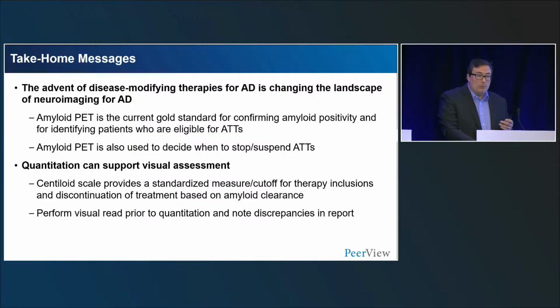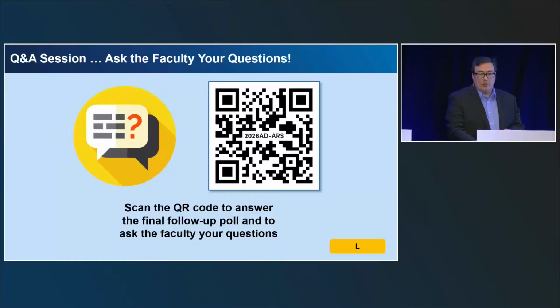I encourage you though, trust your visual read, use it in conjunction with the quantitation. Don't let one supersede the other, and certainly don't let the quantitation change your mind when you're confident in your visual read. If there are discrepancies, that's okay. Note them in your report.